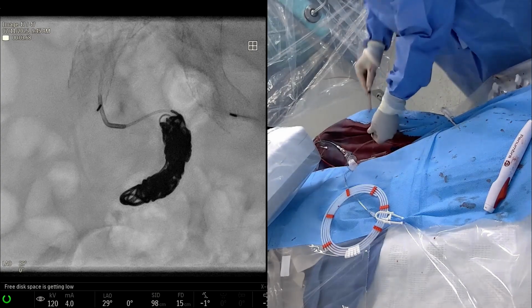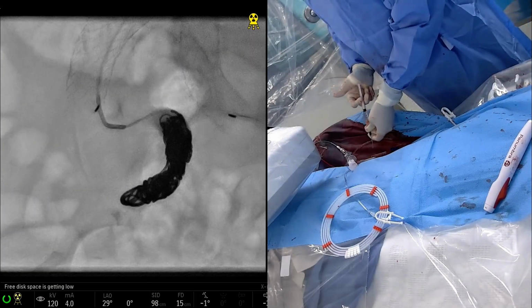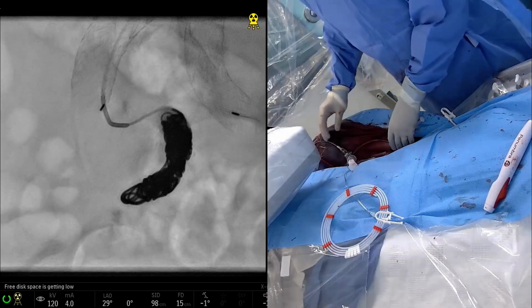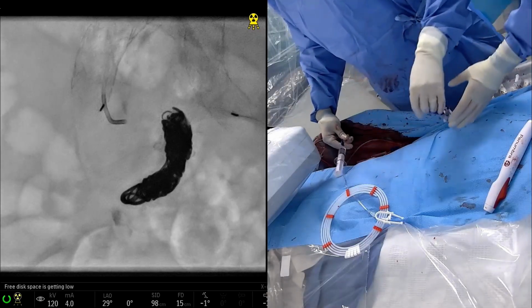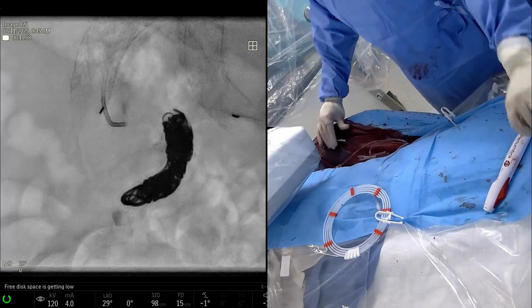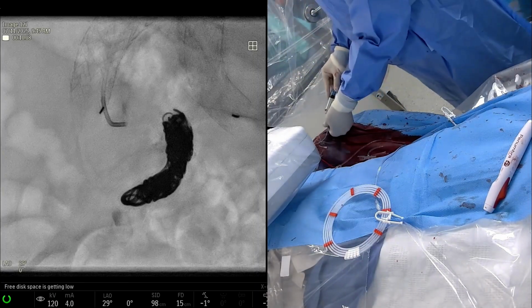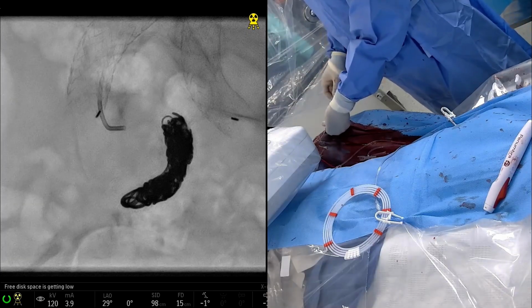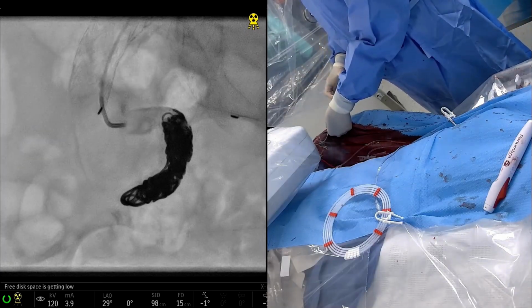I was like, wow. Yeah, now it's done, right? Wow. That was injecting through the microcatheter. You're not even injecting space, and you can see it's kind of sluggish to and fro, which before the flows were kind of bobbing back and forth. I don't see that now. Yeah, exactly. Less so for sure.